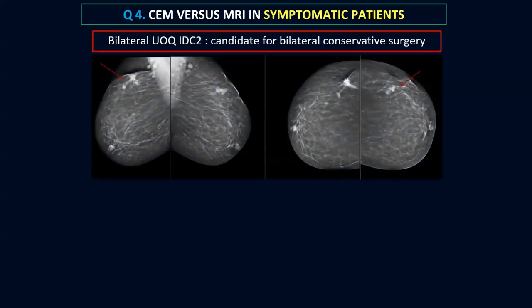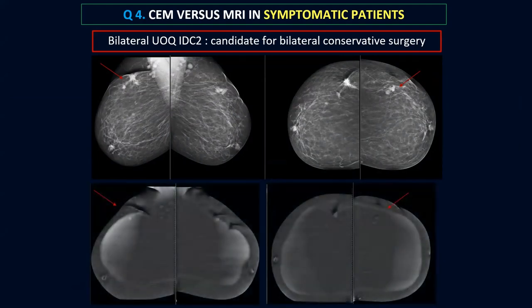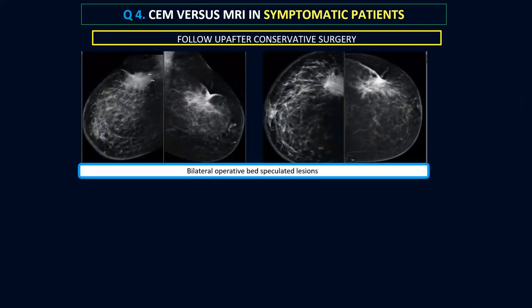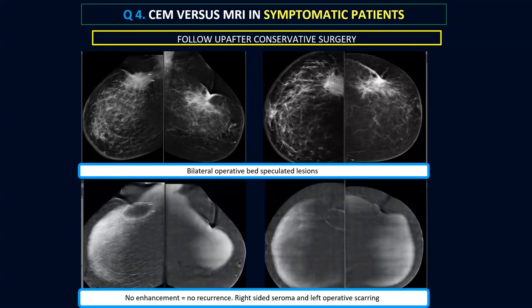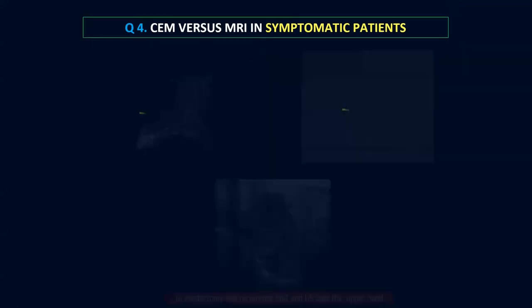Another case: bilateral upper outer quadrant mass lesions — said to be a good candidate for conservative surgery. Pre-operative contrast mammography revealed underlying small enhancing symmetrical lesions in both upper outer quadrants. When she came for follow-up, the mammogram showed apparently spiculated lesions bilaterally, but on contrast mammography there was no underlying enhancement. On the right side, she had an operative bed seroma with a thin enhancing rim — indicating a simple operative bed seroma, not recurrence. There was no recurrence in either breast.